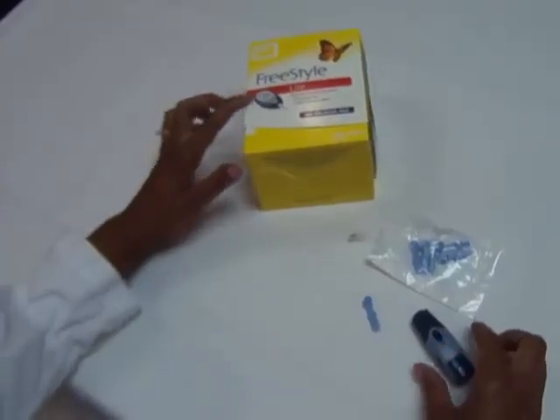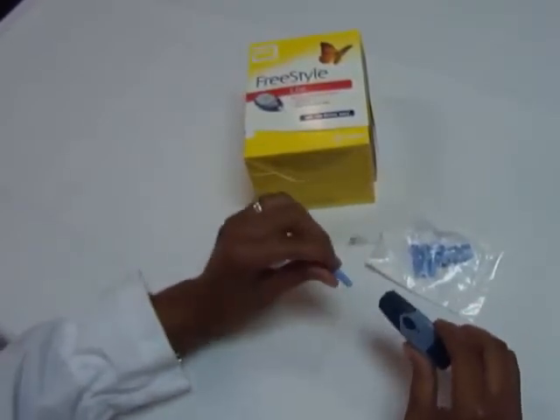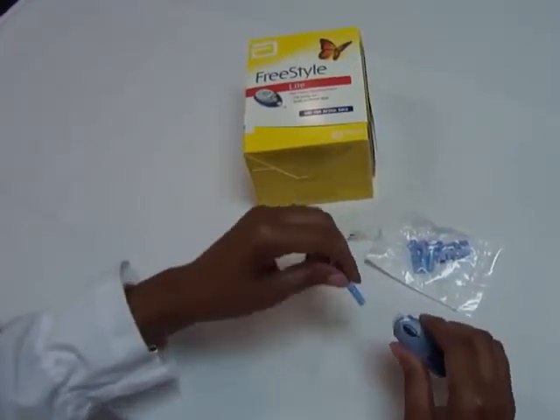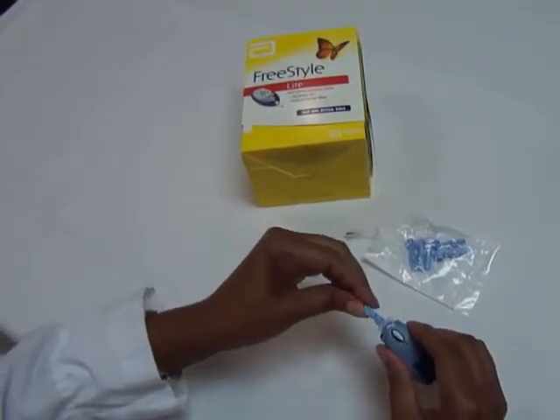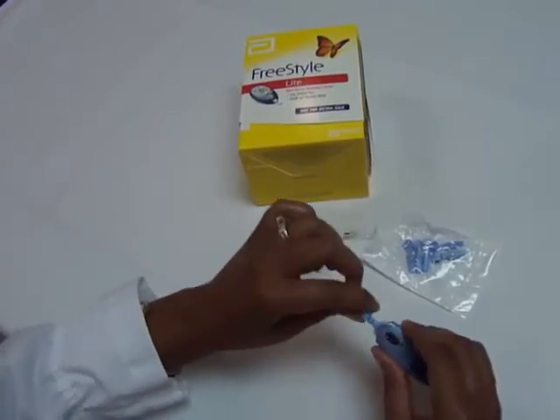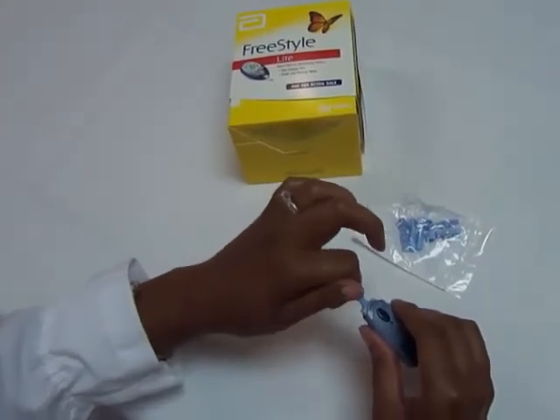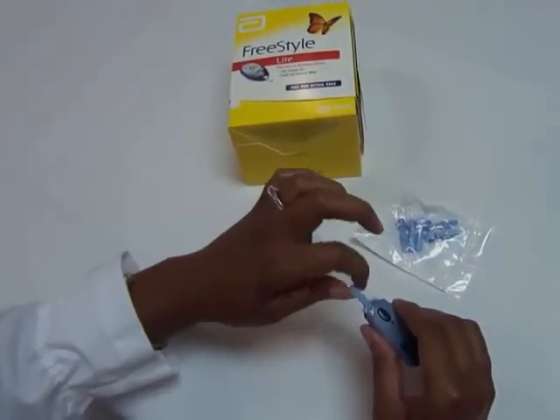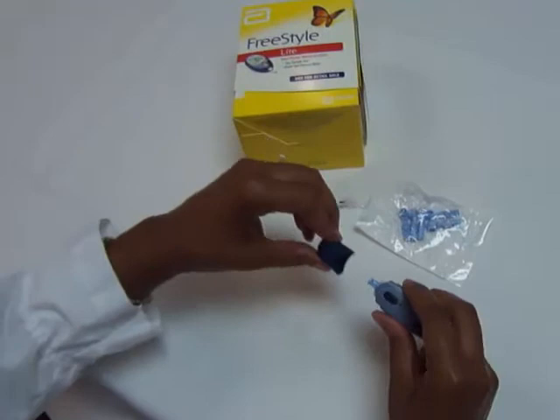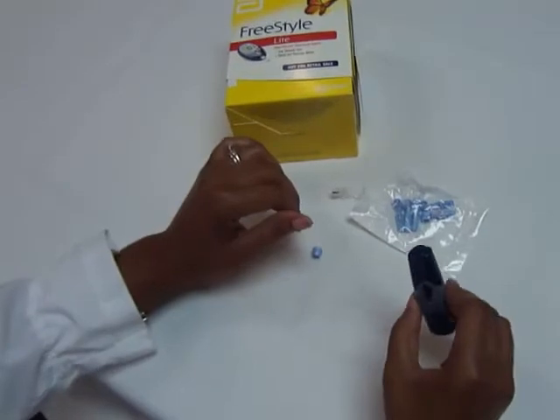This is the FreeStyle meter. This is the lancet and the lancet device. I'm going to load the lancet device. I'm going to take the cap off. I'll stick the lancet in. Did I hear that click? Then I'm going to twist the cap off. Then I'll put the cap back on the lancet device, and I'm ready for my finger stick.